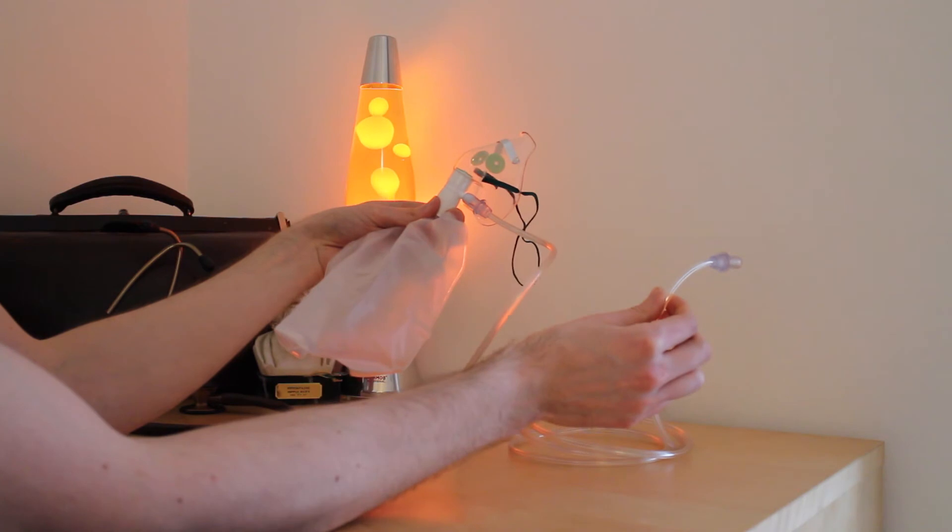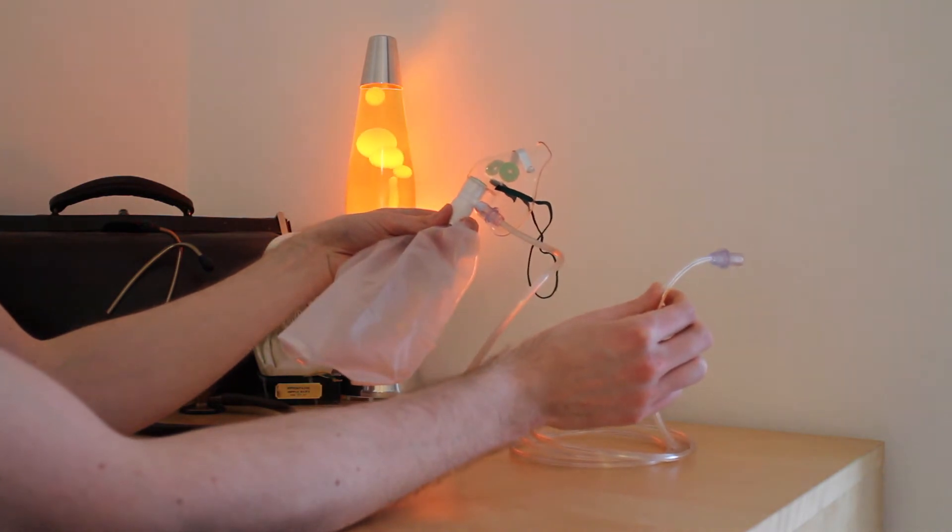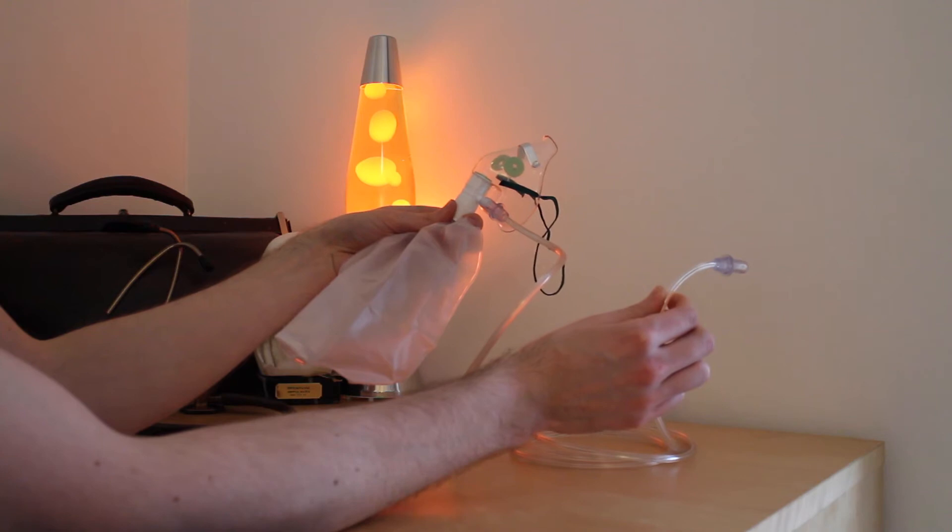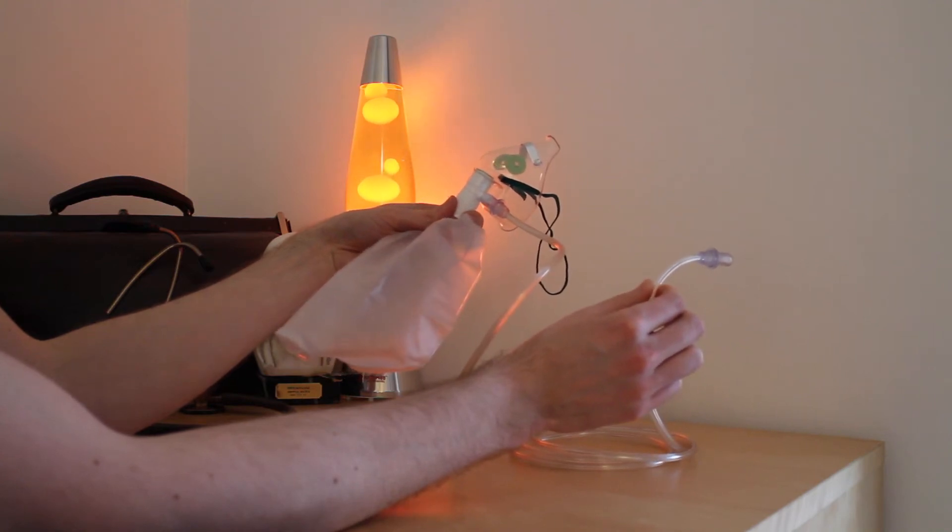The tubing should be connected to the oxygen supply with a flow rate of at least 10 litres a minute but preferably 15 litres a minute.